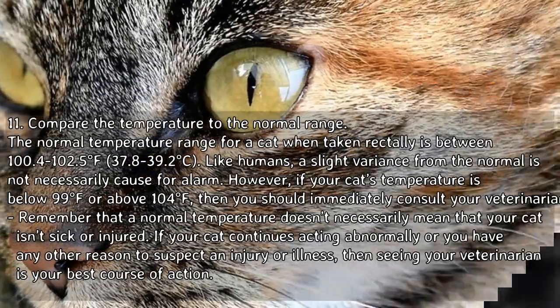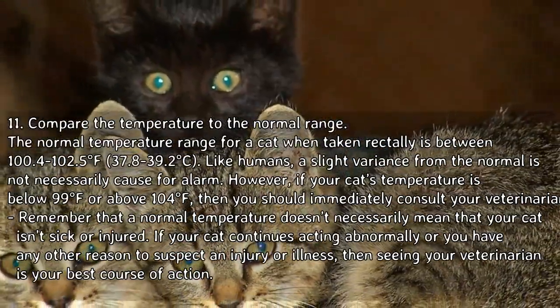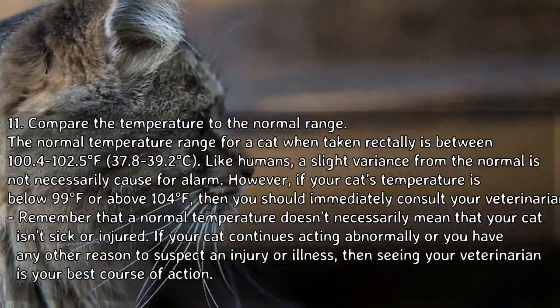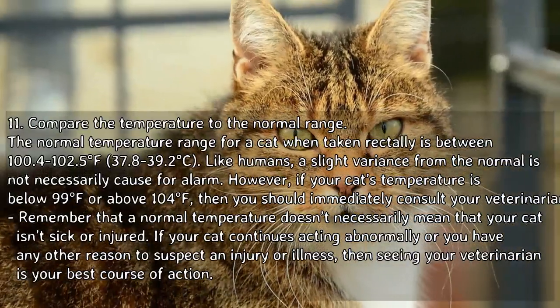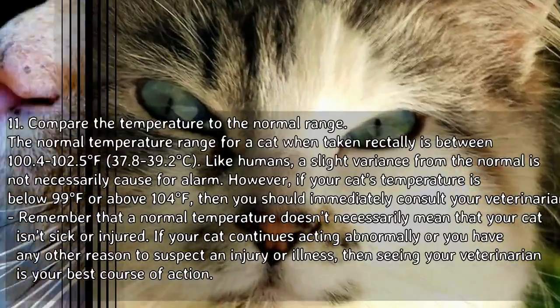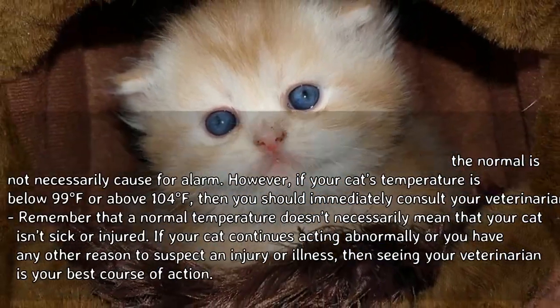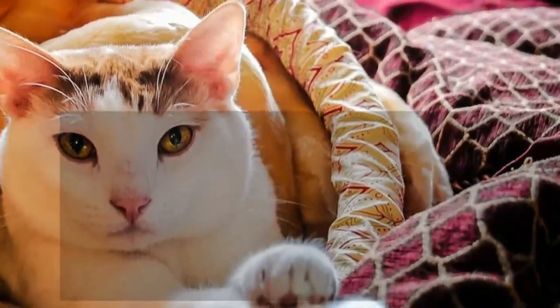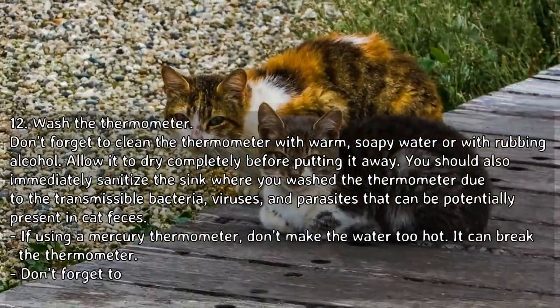Compare the temperature to the normal range. The normal temperature range for a cat taken rectally is between 100.4 to 102.5°F (37.8 to 39.2°C). A slight variance from normal is not necessarily cause for alarm. However, if your cat's temperature is below 99°F or above 104°F, you should immediately consult your veterinarian. Remember that a normal temperature doesn't necessarily mean your cat isn't sick or injured.